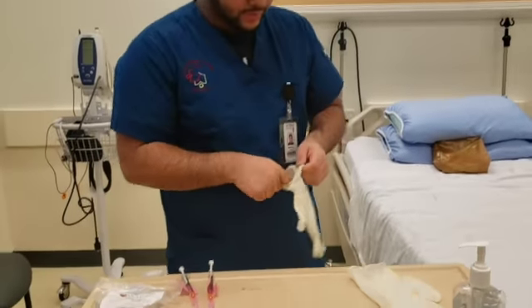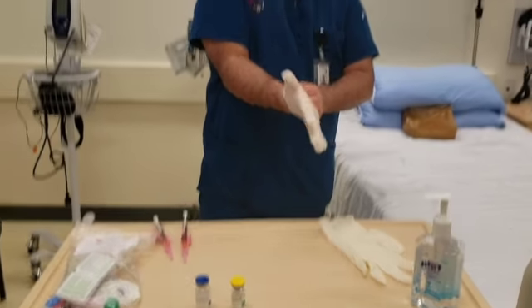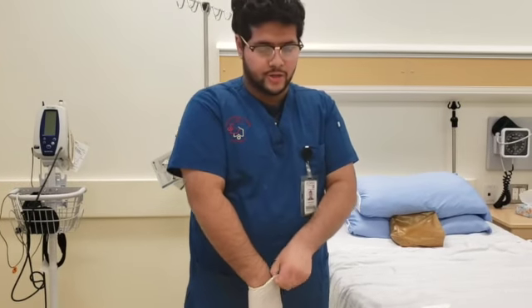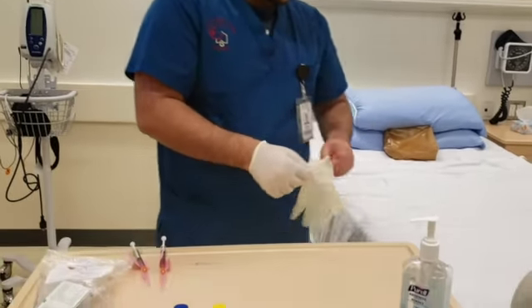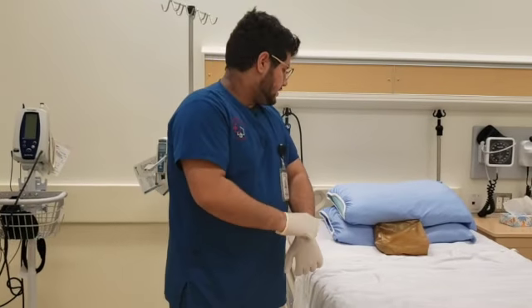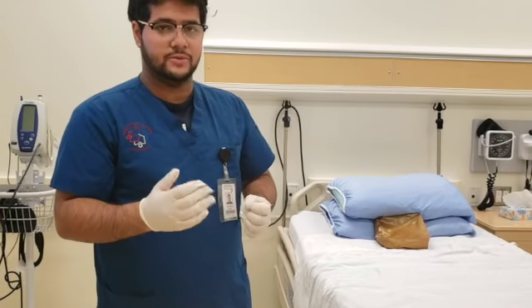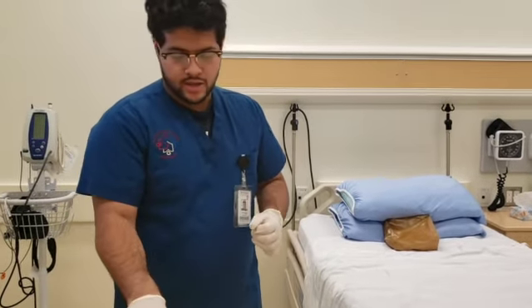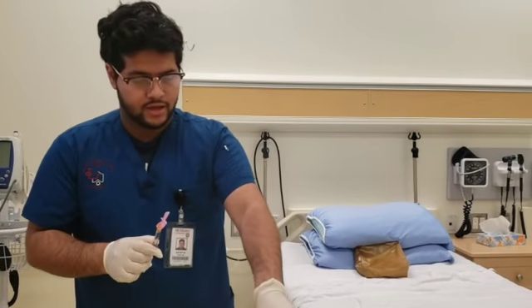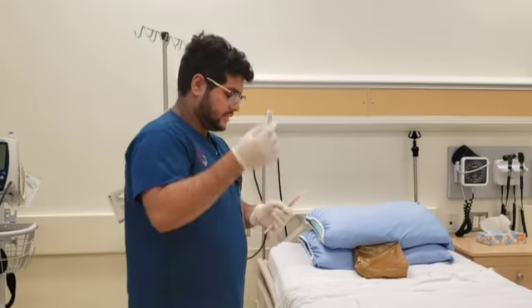We want to put on gloves to make sure that we maintain cleanliness, sterility, and also that when we give the needle, just in case there's bleeding, we don't get the patient's blood on our hands. And now, after inspecting the skin, first I'll be giving the heparin, which is subcutaneous at the abdomen. I've already inspected the skin to just see that there's no other lesions. Take the alcohol swab.